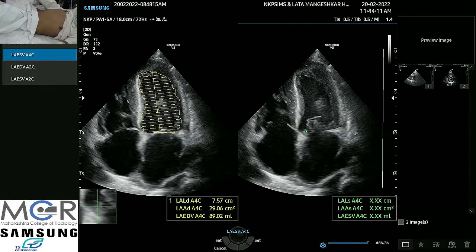Mr. Sharma, who is the application engineer for this machine, is kind enough to come here and support me, because this is an absolutely new machine for me. We have a little earlier version of a similar one, that is also very good.